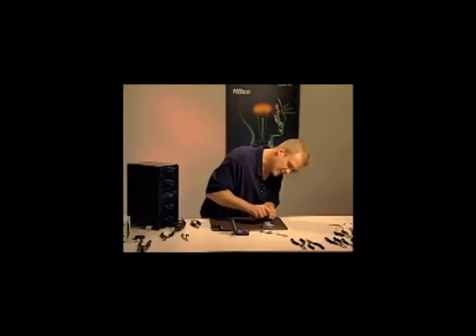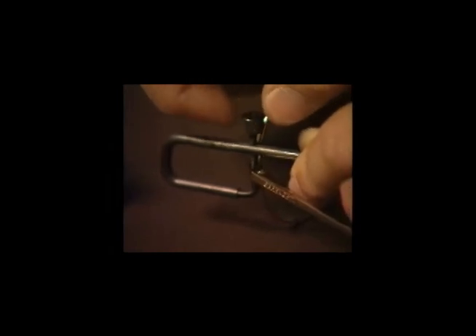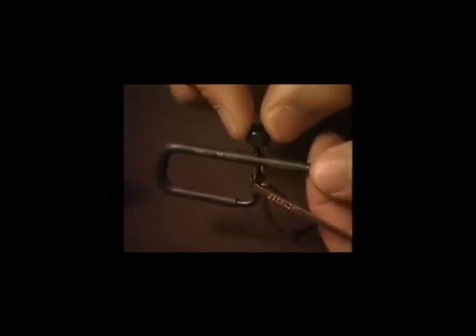It's actually designed so it self-aligns. It doesn't matter if the screw is countersunk or if the head is sticking up out of the hardware. It will either seat itself in the hardware or grip the screw entirely. Once I get it just very, very light, I don't really tighten it down, I just give it a little wiggle, and sometimes it'll snap right into place, and it did for me just there. So I know it's perfectly aligned, and then just finger tight. You don't need a wrench or a plier to tighten that down.